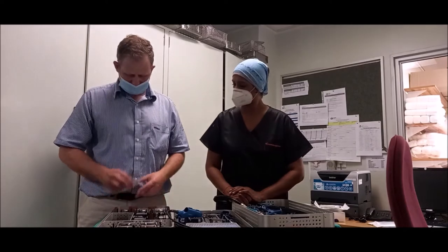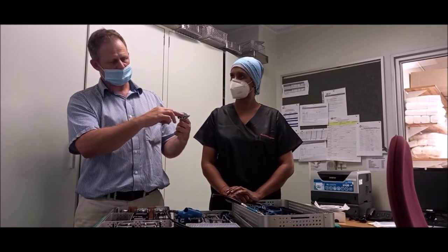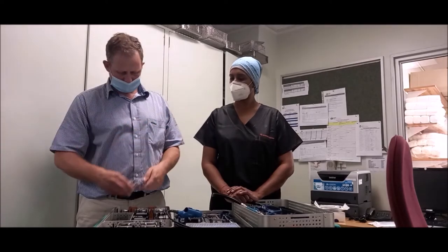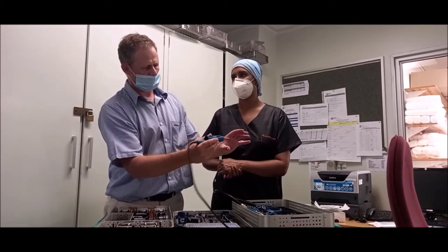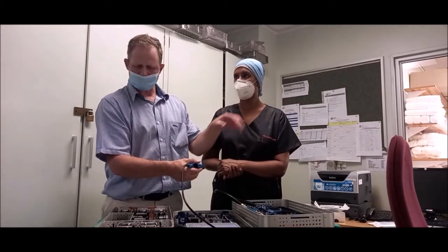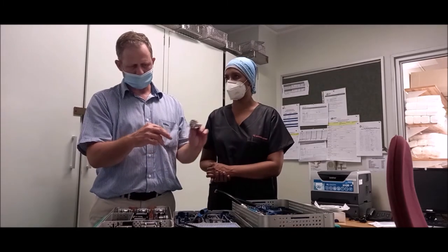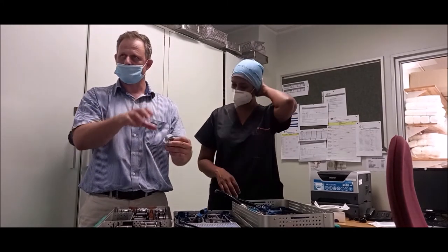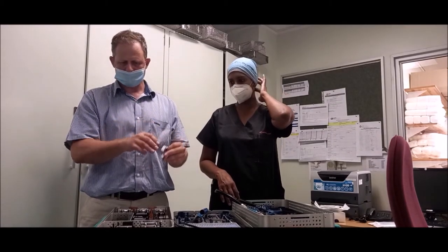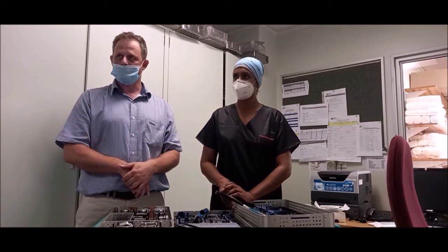Previously we used jigs — we'd screw them into the femur and cut through with a saw. Now we don't need to use those jigs. We can just use this device, contour the knee, and it cuts for us. Instead of putting a jig onto the femur and manually measuring angles to make the bone cuts by saw, this just takes the guesswork and human error out of the process.